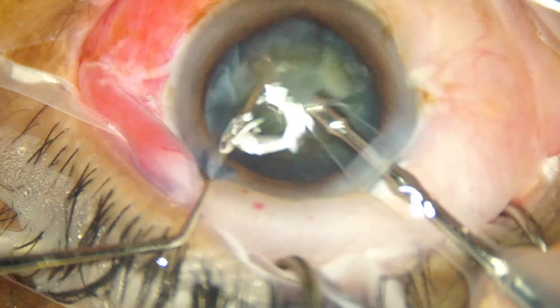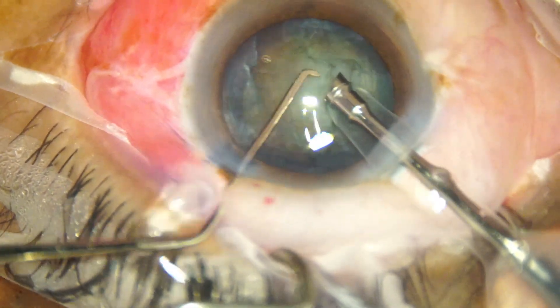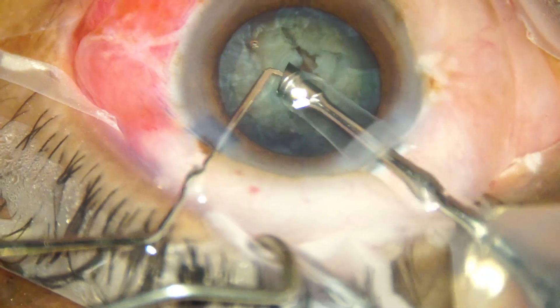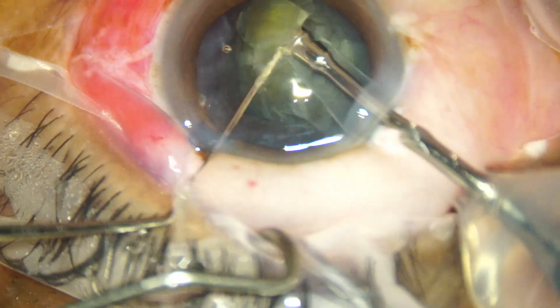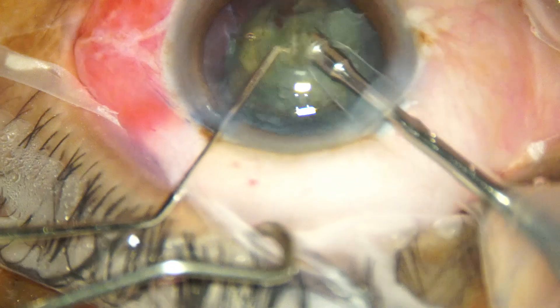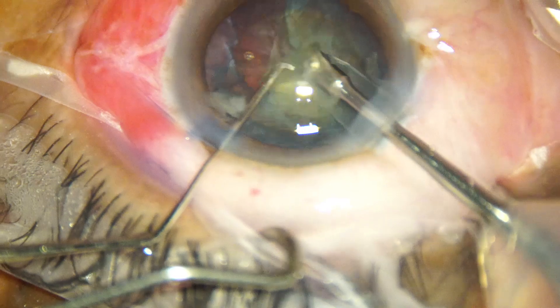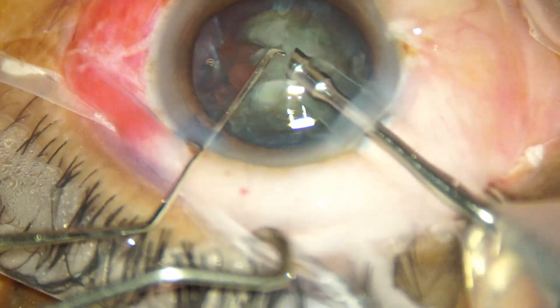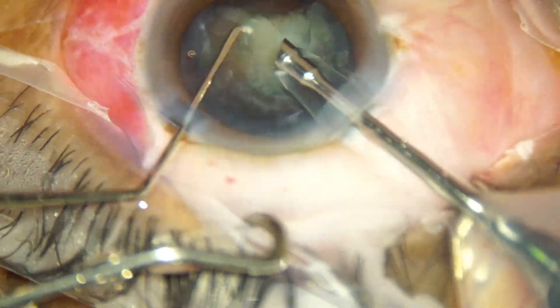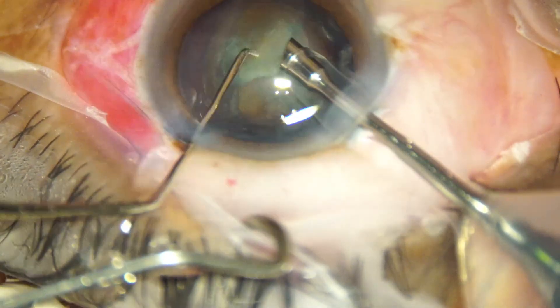Now she turns the nucleus — there is a crack — and just beside that she holds at the right place and gets a very good crack. This free nuclear fragment is emulsified by her, then another free nuclear fragment. In soft cataracts it does not matter — you can chop and eat. In hard cataracts you should chop first and then start eating off the pieces.